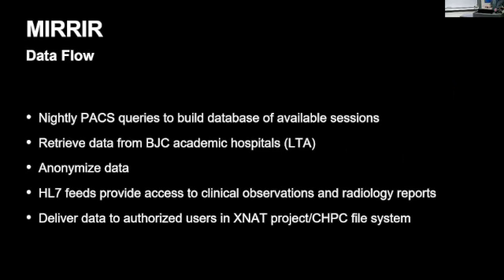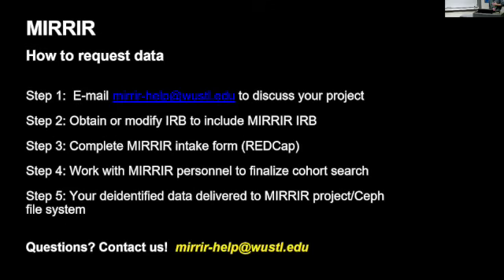And it's basically doing that. It's going out nightly and querying the PACS to see what's there, pulling that in as something available into MIRRIR, and so then we can do requests. Researchers can put in a request for data, and we do the data pull, and we get an anonymized data set. It can be supplemented with radiology reports and clinical observations, and then it gets delivered in a project in MIRRIR, or we're promising to make it available on the CHPC on the file system.